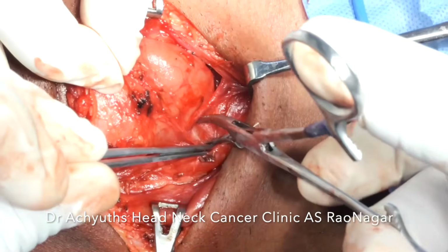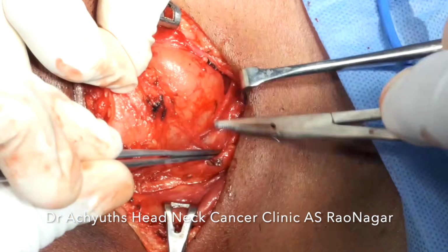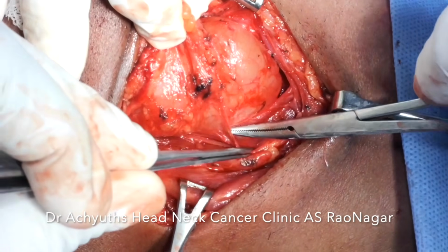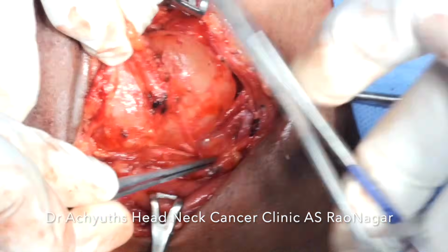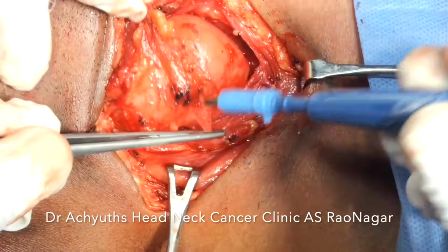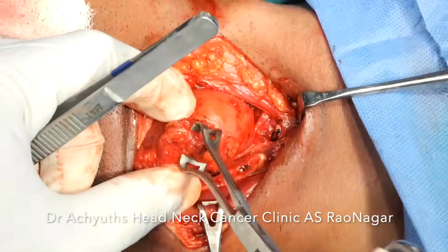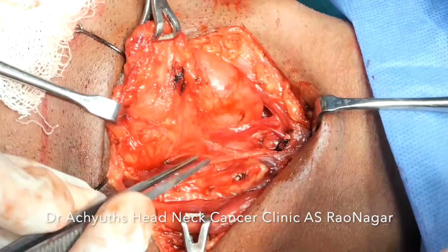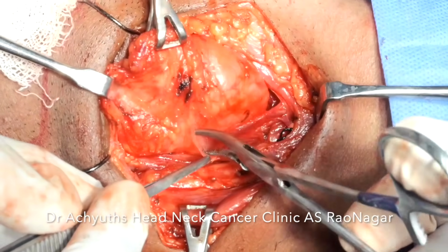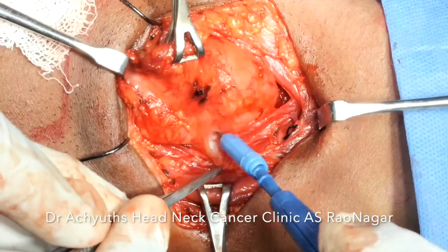Actually, here if you can palpate, you can feel the pulsations of the carotid artery. Between the carotid artery and the internal jugular vein lies the vagus nerve, but it is placed more posteriorly. You usually do not see the vagus nerve even during neck dissections, unless you specifically search for it, maybe while doing the V1 and V2 for thyroid surgery nerve monitoring, but that is also not done by many surgeons. We usually see only R1, R2.